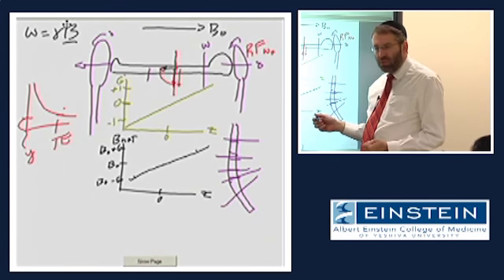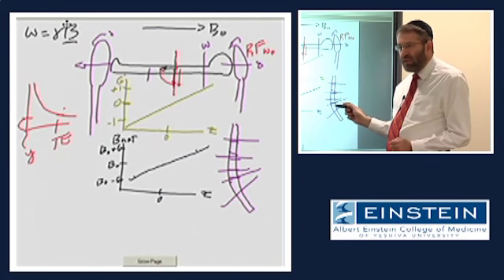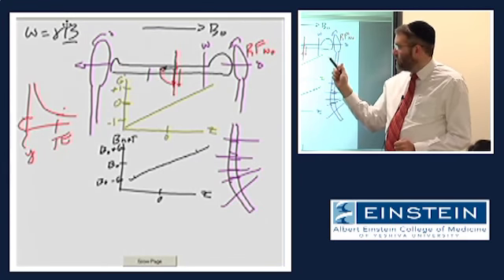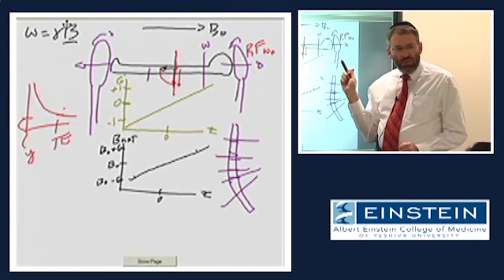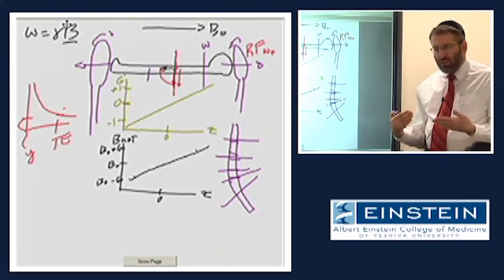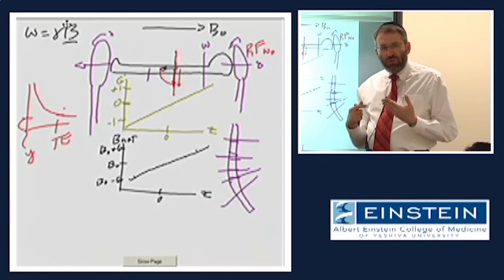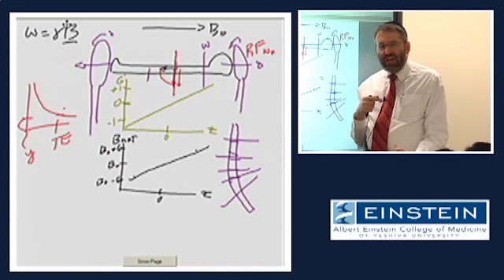And there's no reason why we're limited to that. In order to generate this type of oblique, you simply have to turn on more than one of these gradient magnetic fields. The key point to keep in mind is that the direction of slice selection will always be perpendicular to the direction of the net gradient magnetic field.